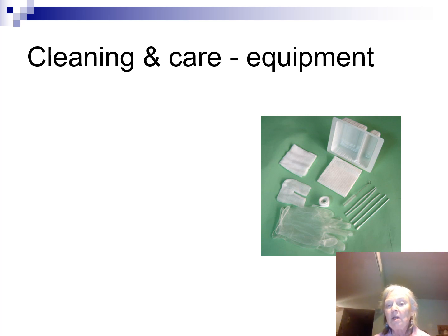Here's some sterile gloves. This is a brush that we would use for cleaning. And then this is like a tweezers that you can use to help you pull the ties through. And then you have some sterile Q-tips. So this is a really nifty trach cleaning kit. Not all the hospitals use them. Sometimes you have to put your kits together yourself.